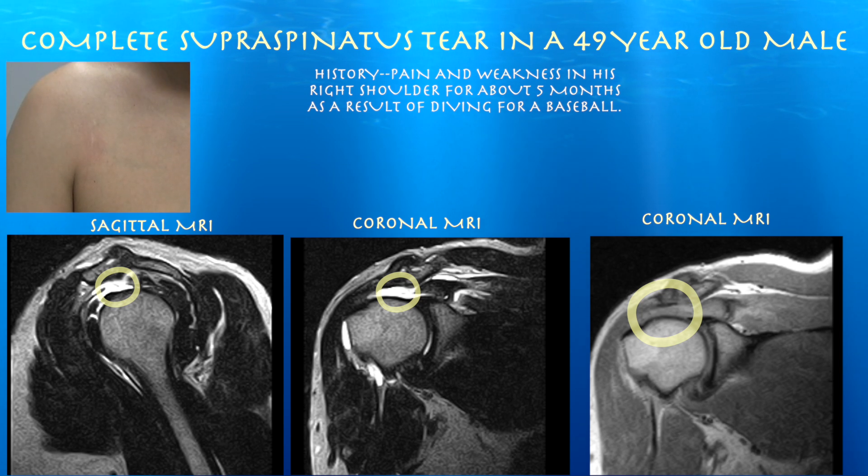Otherwise, his infraspinatus is intact, and subscapularis tendons are intact. Also, the biceps tendon is intact as well.